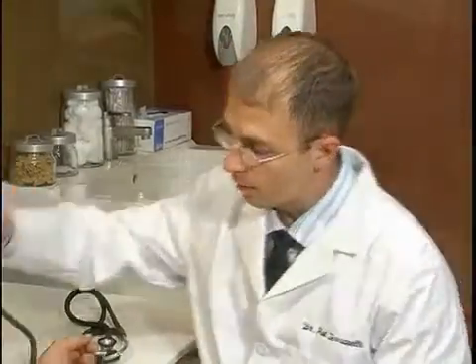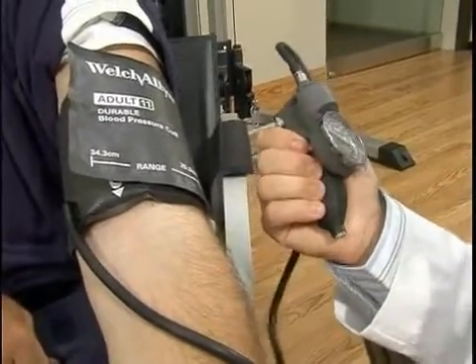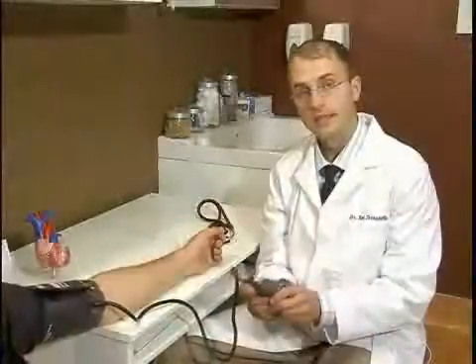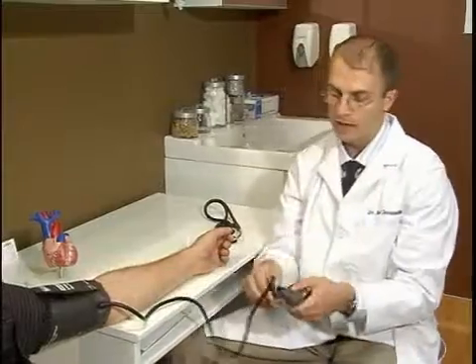So now we want to inflate the cuff. An important part of this is making sure that the dial on the blood pressure cuff is tightened all the way up, so that when we pump the air through, it's going up into the cuff and not out the side.